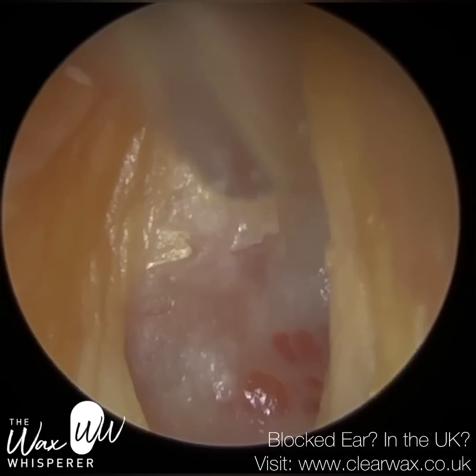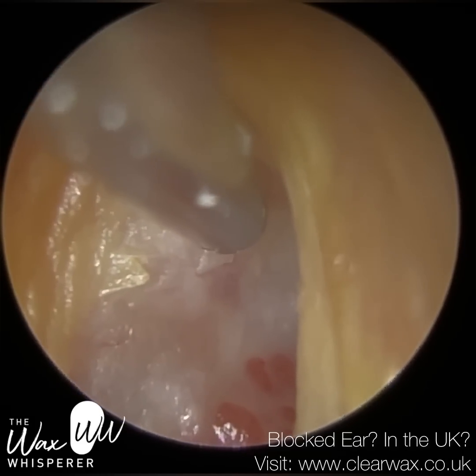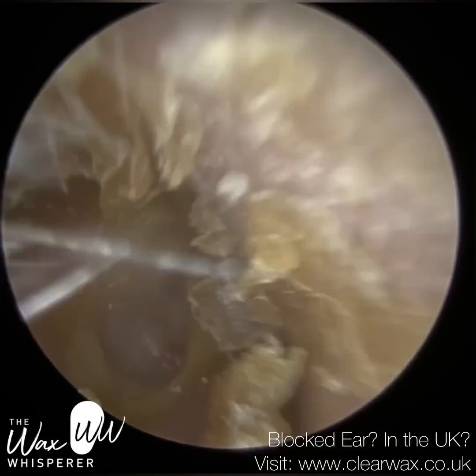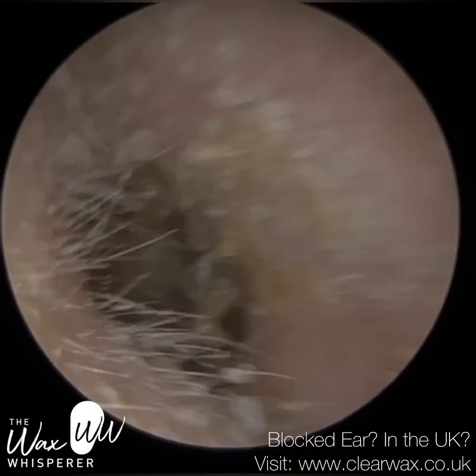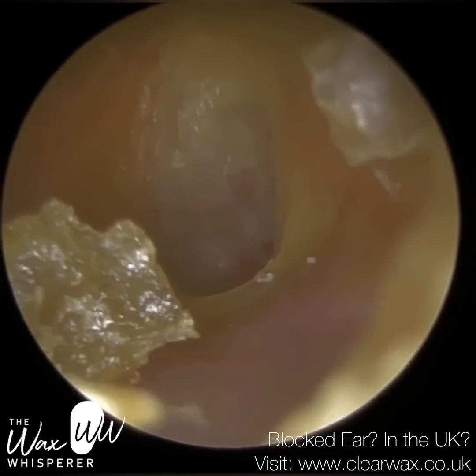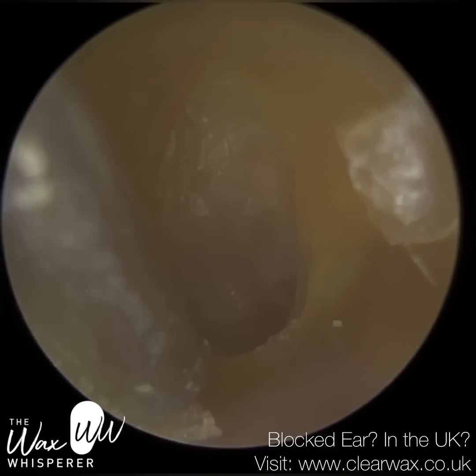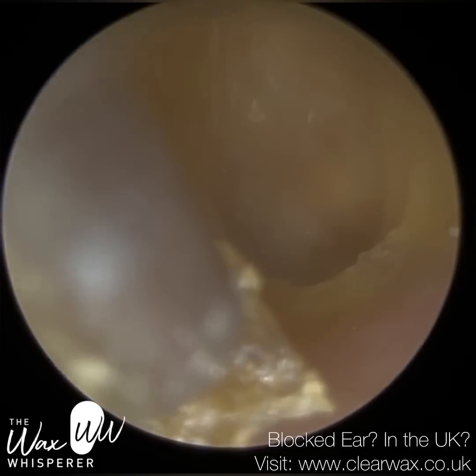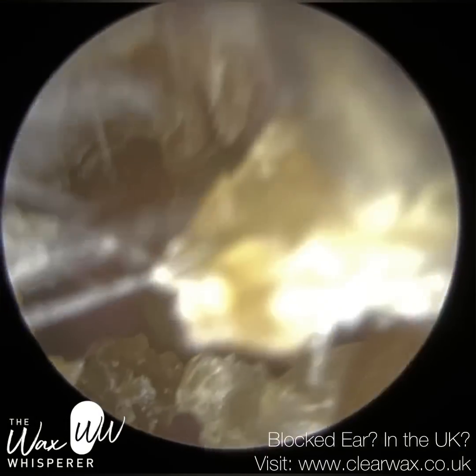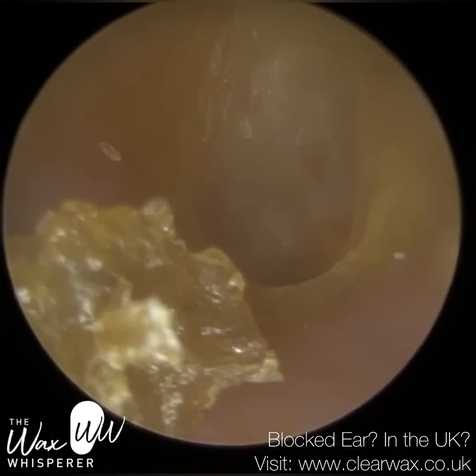Granulation tissue is inflammatory tissue. Whenever you see it, you know there's been some inflammation, some trauma, and the ear or the body, wherever you may see granulation tissue, is trying to heal. Quite often you can develop granulation tissue, which is connective tissue that has its own supply of blood capillaries. And it gives this very bumpy, moist, red, fleshy appearance. So this patient is obviously going to need some medication.